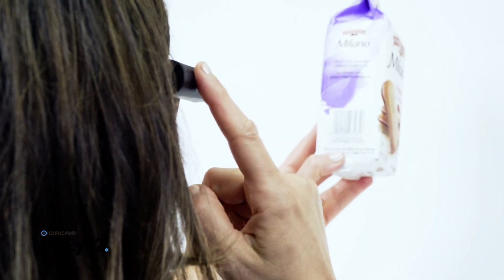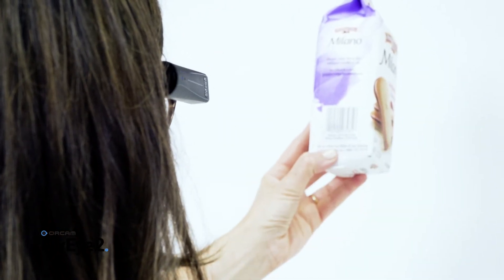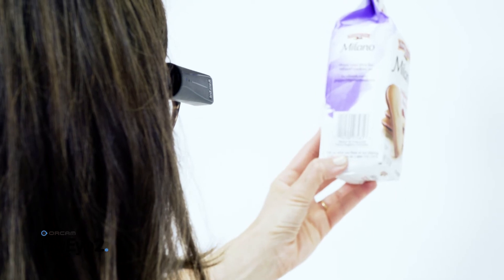Pepperidge Farm Milano raspberry flavored chocolate cookies. Press the touch bar. The device will take a picture, recognize the barcode, and announce the product information.